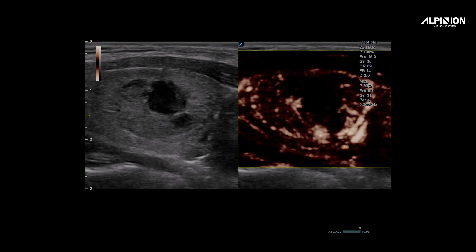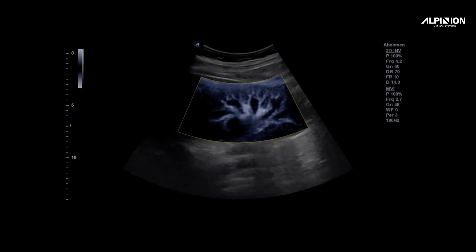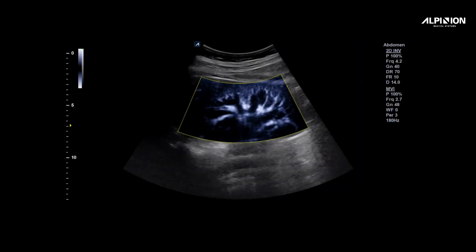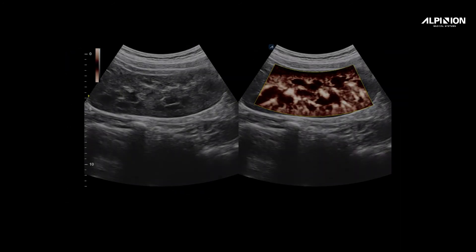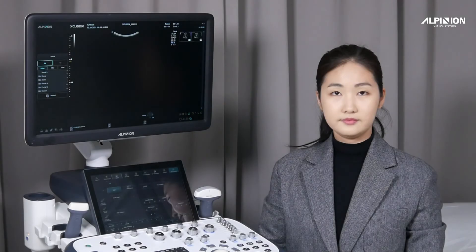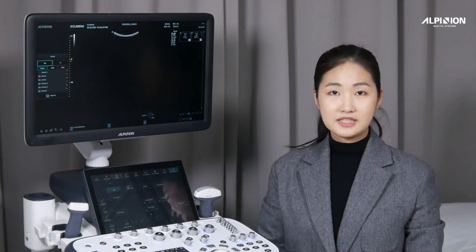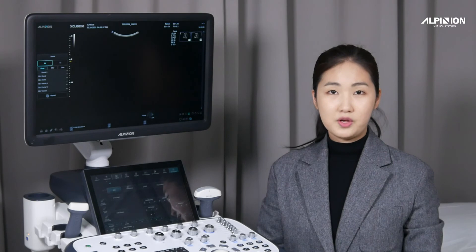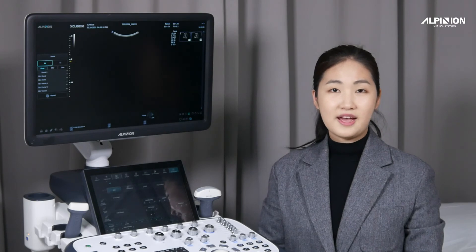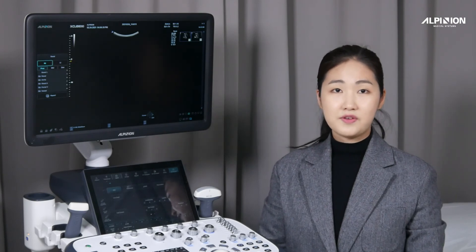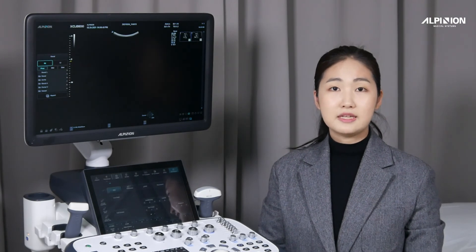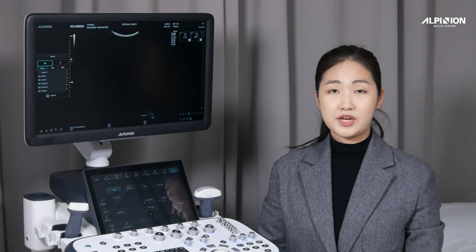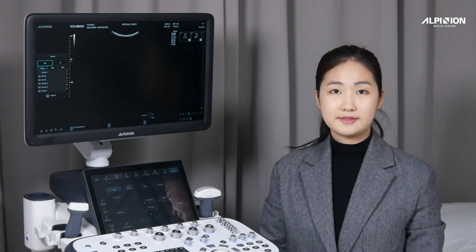It aims to detect ischemia, inflammation, vascularity, and flow characteristics of a foreign body or a lesion. Expo's micro-view, when it matters most, detection of vascularity is a key to diagnosis, by surpassing the limitations of traditional flow modes.